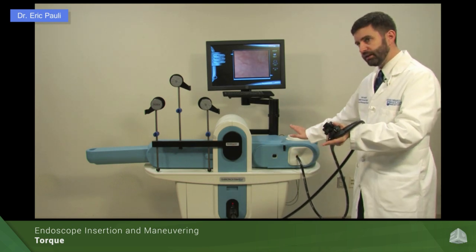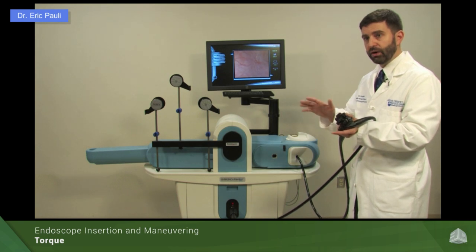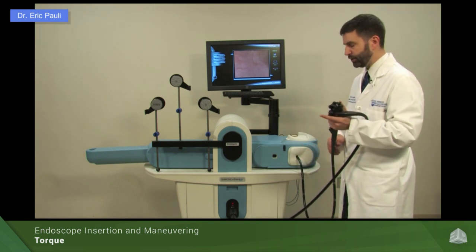If I take a step back and make as straight a line as possible, I can make that torque work a bit better. The more of the scope that is in the patient — or for upper endoscopy where the scope is simply shorter in general — the torque translates in a one-to-one motion much better. So there are two ways to torque: with the left hand, or with your right hand directly on the insertion tube.